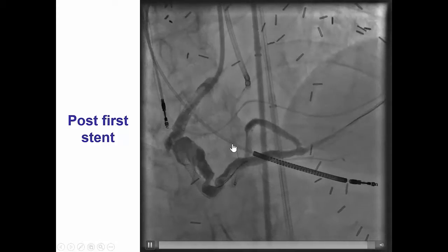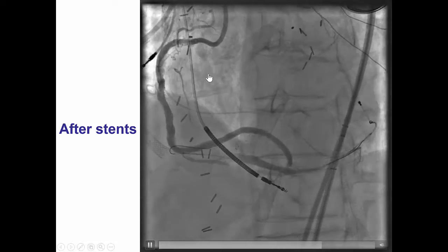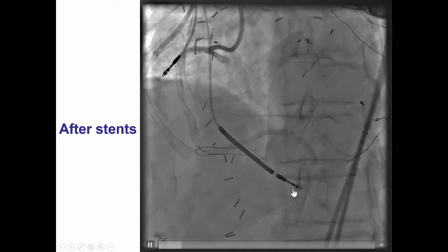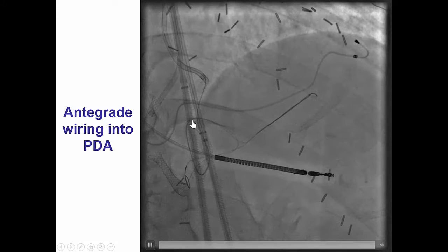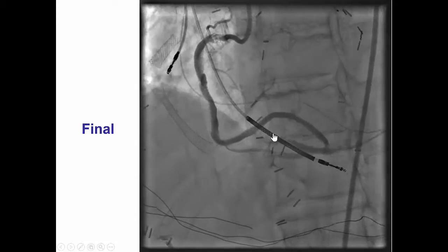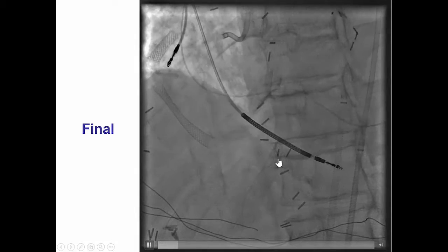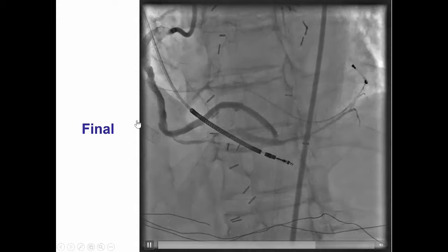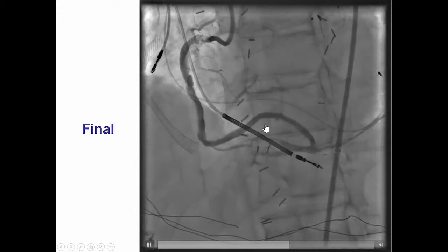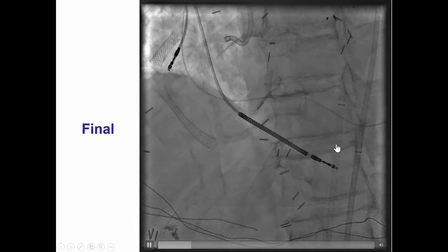After placing the first stent, there was some retrograde flow into the native right. We lined the entire right coronary artery with drug-eluting stent, and after doing that, we were able to restore TIMI 3 antegrade flow into the right posterior descending artery, with some retrograde flow back into the diseased aneurysmal saphenous vein graft. It was very challenging to advance an antegrade wire into the PDA, but we were finally able to do it. However, we could not deliver a stent-to-stent into the PDA, so we left the patient with this result. We elected to have the patient return in a few months for coiling of the vein graft after ensuring good flow in the right coronary and growth of the distal vessel.